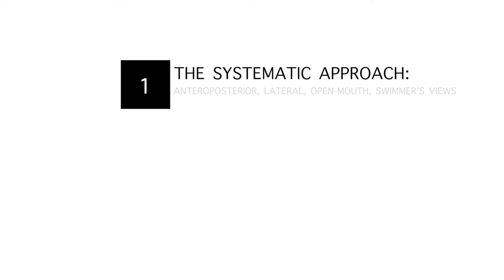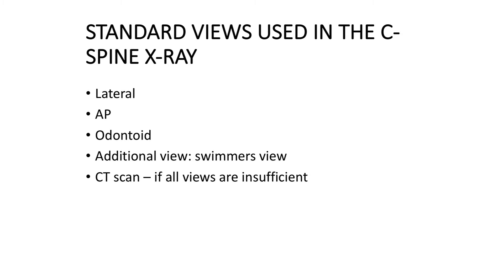This is an approach to a normal C-spine X-ray. The standard views used in the C-spine X-ray are the AP, lateral, and open mouth views. There are also additional views such as the swimmer's view or the flying angel view. A minimum of three views are required — the AP, lateral, and open mouth views — to ensure that no injuries are missed.